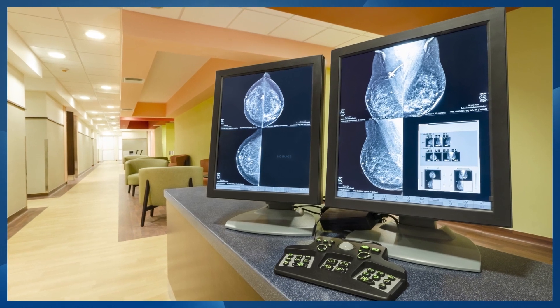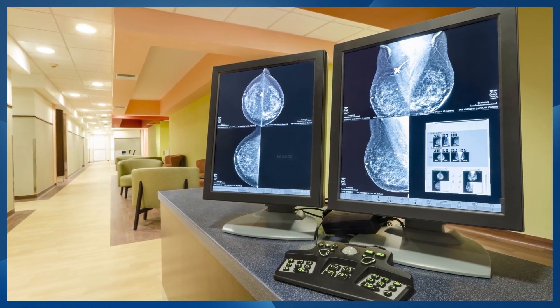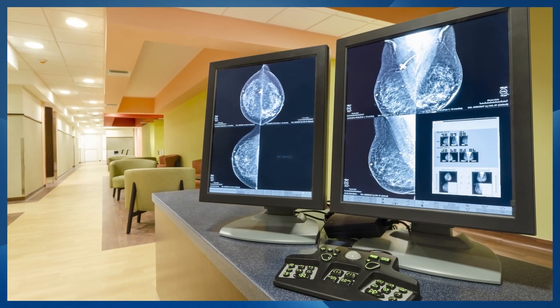Mammography is a very user-dependent modality. BreastScreen has developed a strict grading system to determine whether an image taken is acceptable or not. The quality assurance and quality control required of a mammographer is quite high due to the importance of early detection. It's very important to get as much breast tissue as possible on all projections taken — missing anatomy can lead to missing pathology, which is detrimental to a patient's prognosis.